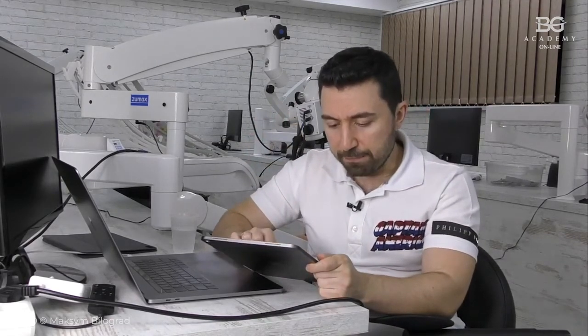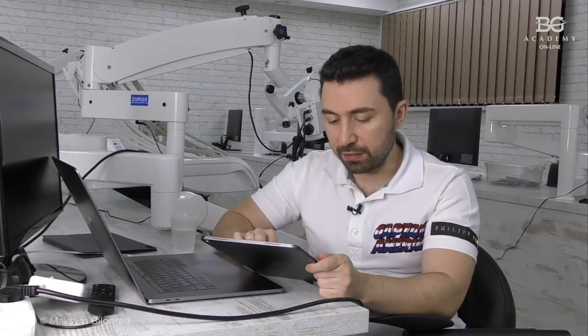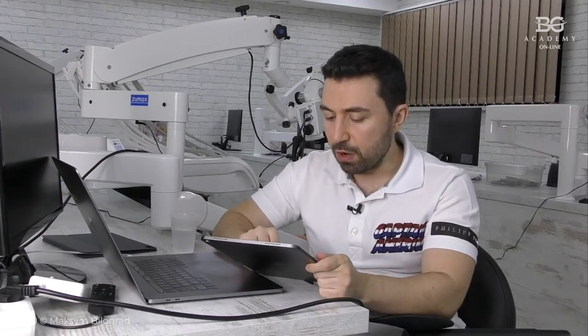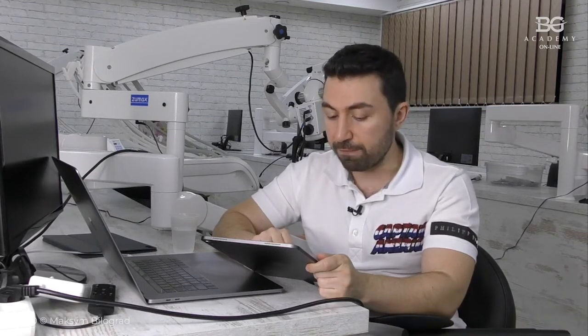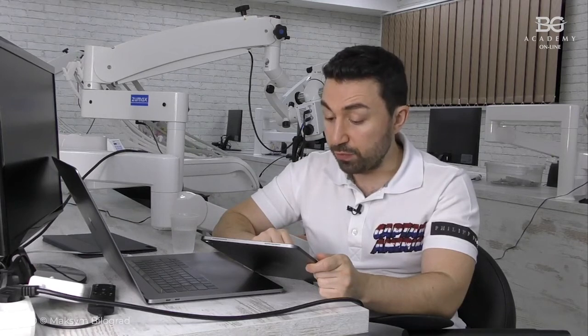Okay, another question is from Ayman Hadi. Thank you for the very useful clinical tips. In case of misfit veneers during placement due to excess cement, you couldn't check the fit properly. So after cementation, is there any way to fix this problem?